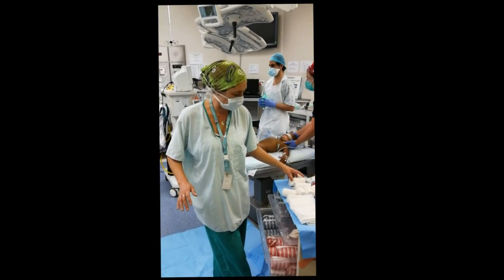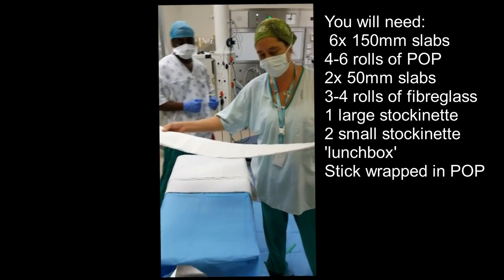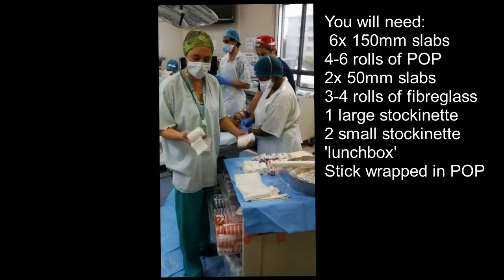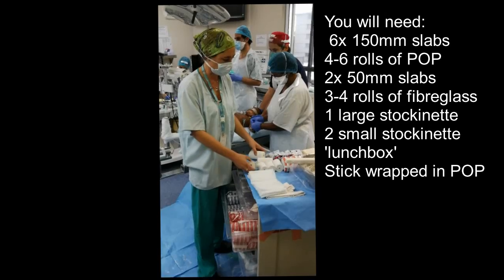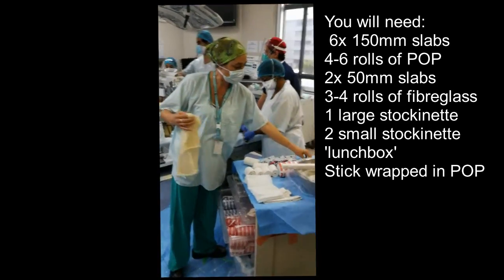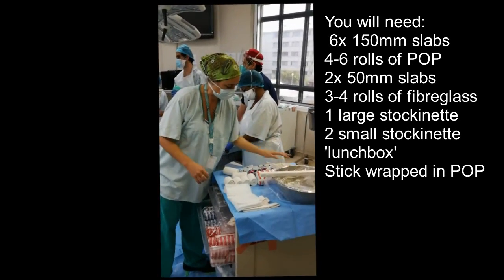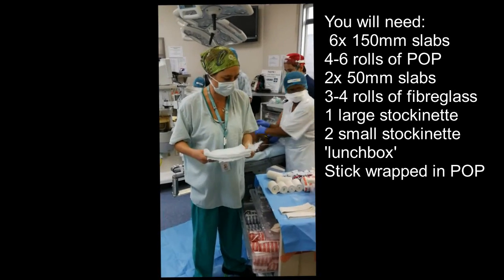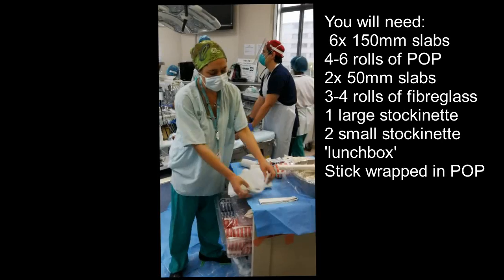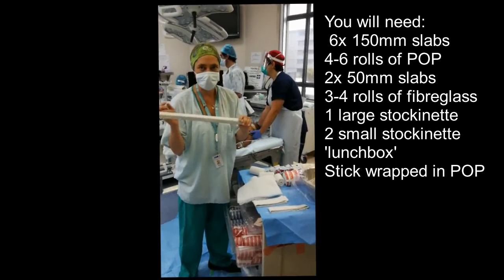Before you start, it's important to prepare everything you need. Start with six slabs of 150mm plaster. You need four to six rolls of plaster of Paris in various sizes, a large stockinette for the body, two small stockinettes for the legs, some Dinoc tape, a lunchbox to pad the abdomen to allow for chest and abdominal distension, and two 50mm slabs for hip reinforcement.